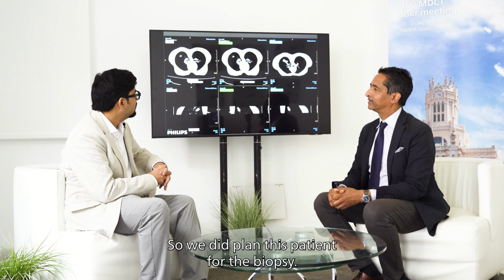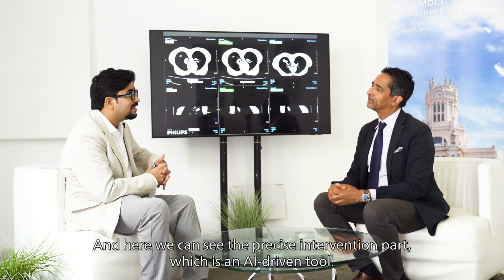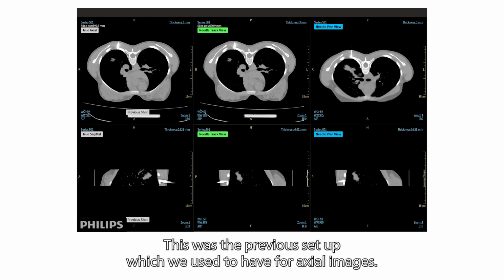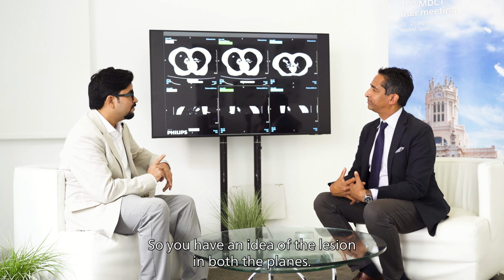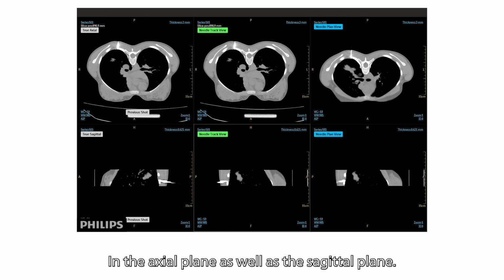So we did plan this patient for the biopsy, and here we can see the precise intervention part, which is an AI driven tool. Here we can see three images. One is your true axial images. This was the previous era, where we used to have axial images, but in addition to this you can also see there is a sagittal multiplanar formatted image. So you have an idea of the lesion in both the planes, in axial also, in sagittal also.